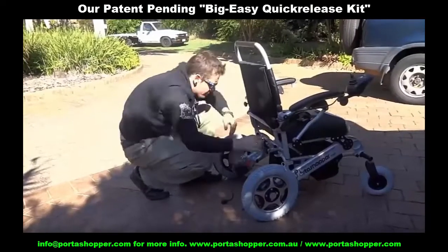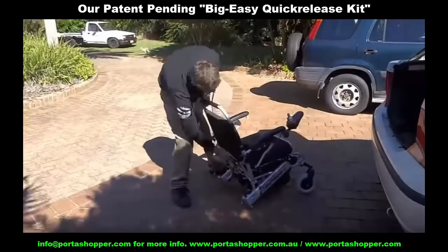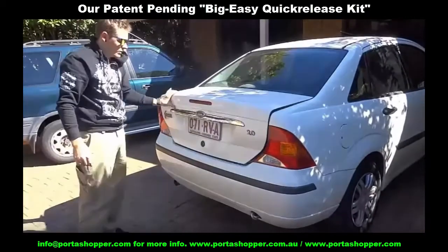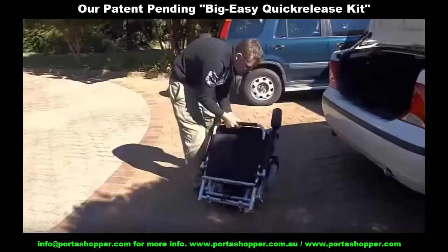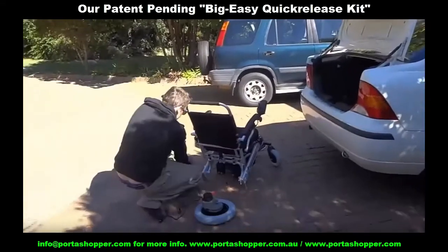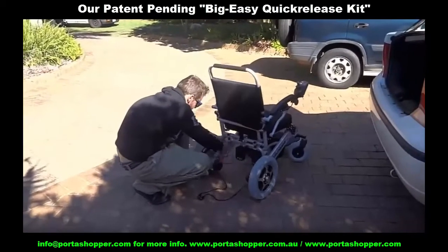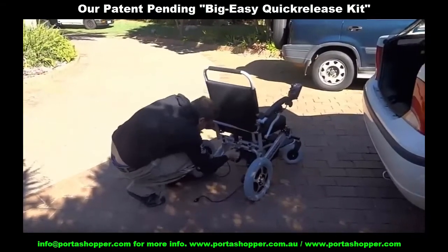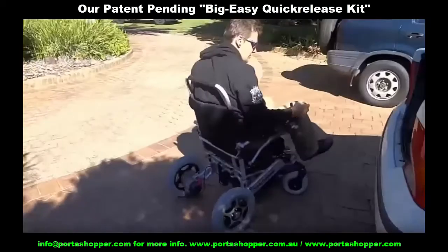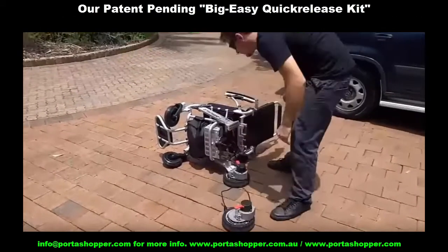Next, consider the weight of the wheelchair and whether you can lift it. You may think that 20-odd kilograms or 55 pounds is fairly lightweight when it comes to wheelchairs, and you are right when compared to standard electric wheelchairs. But have you checked if you or your caregiver can actually lift 20 kilograms or 55-odd pounds into the car boot or trunk by yourself? First check and make sure by finding something of similar weight and lifting it into your car. You'll see it's not as easy as you may think, especially if you're a little older and weaker.